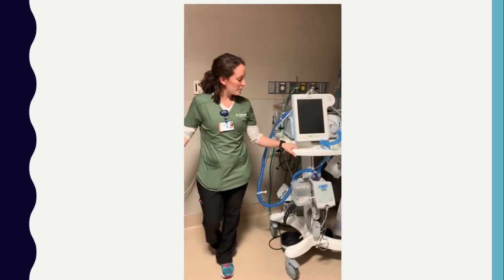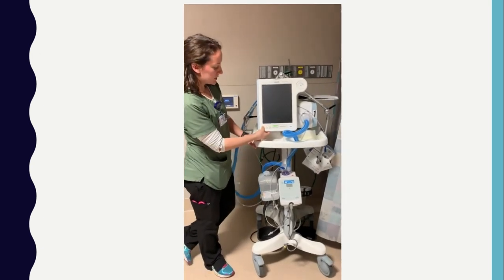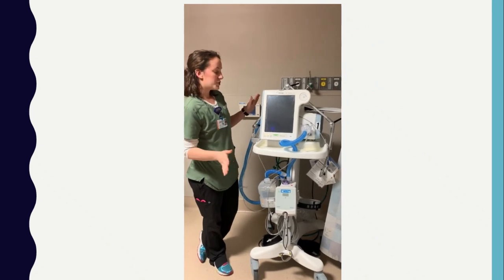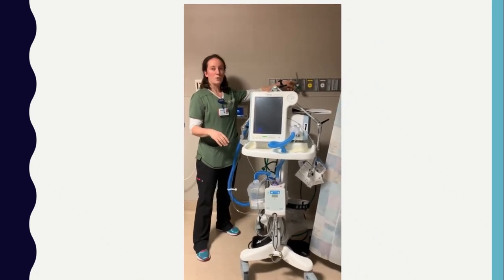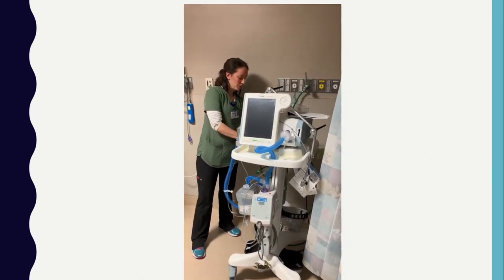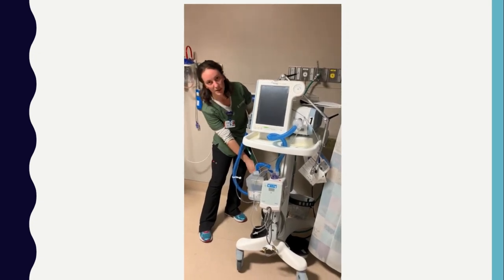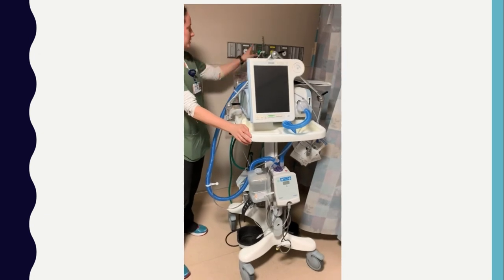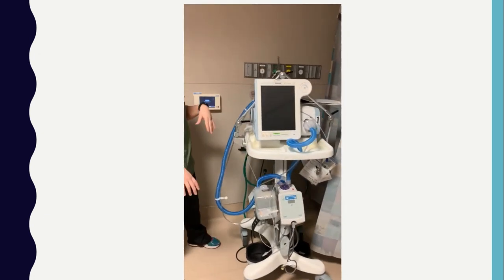Going over to our BiPAP machines. These are our V60s, these are our Respironics. Pretty simple to use also. First things before you turn them on, you want to make sure that you have your O2 tubing connected to the wall outlet. These are transport vents as well. So you have little O2 tubings right here that can connect to cylinders that will attach right here at the bottom of our V60s. But we do want to make sure that they're plugged into the wall outlets whenever they're in a room. That way we're not using our tanks and everything.